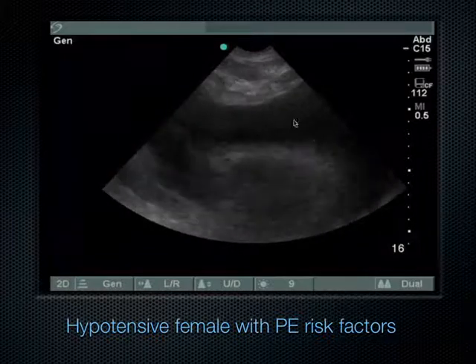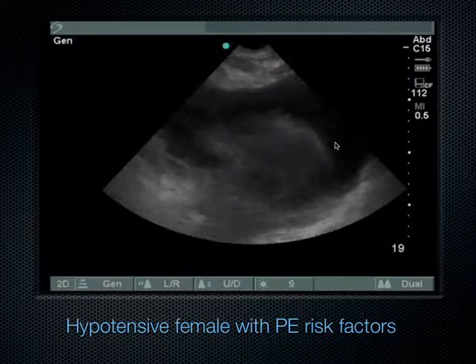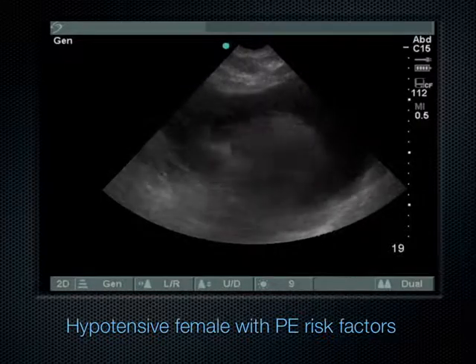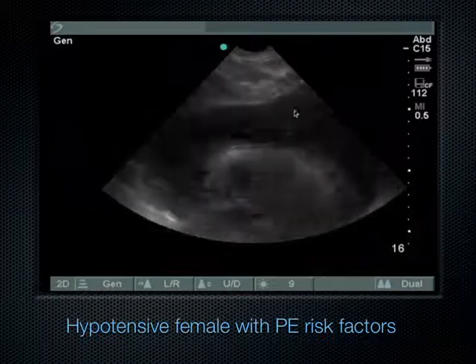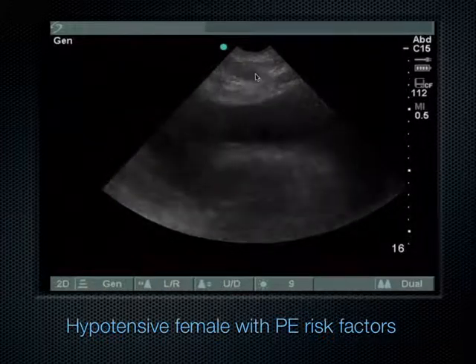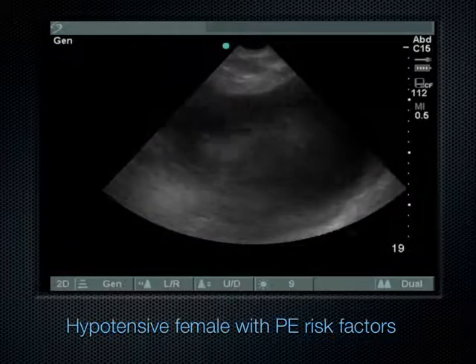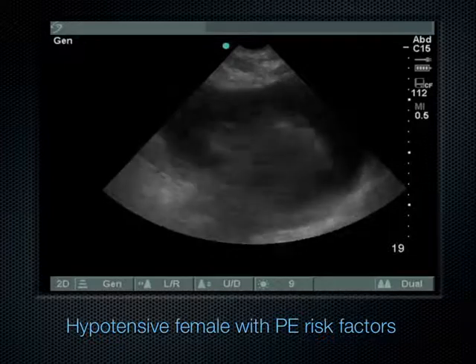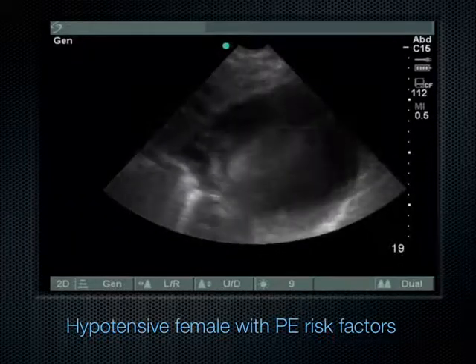This is a massive pericardial effusion. In fact, it's tamponade. How do I know? Because the heart is swinging back and forth. And if you did an EKG, you would likely see what? Low voltage EKG, exactly, because of all this fluid here. It's hard for the electrical impulses to make it all the way to the skin line. However, sometimes you get lucky and you see the electrical alternans, and this is why, because the heart swings back and forth. But the most common finding of pericardial tamponade on an EKG is actually low voltage EKG.